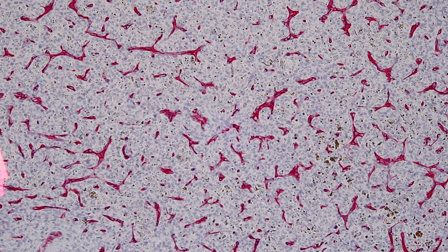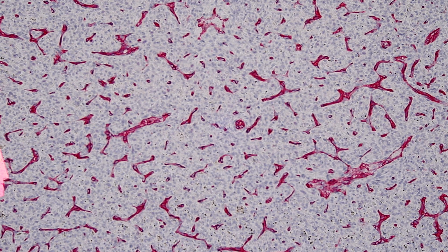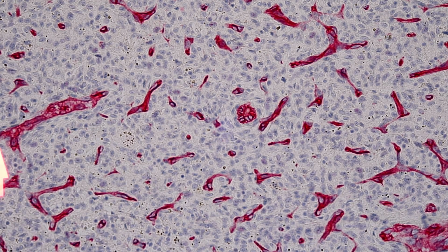I've seen occasional times where people have misinterpreted a CD34 or other vascular stain as being positive when it was actually only staining a really prominent background vascular network in a tumor. So make sure you recognize this is negative CD34. All it's staining is the normal vessels, which is the usual pattern, but the tumor cells in between are completely negative and devoid of stain.